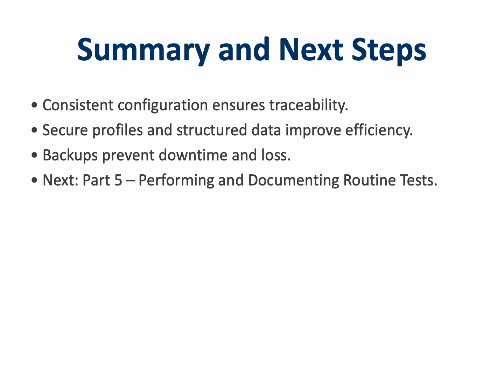Configuration determines whether your Rigel 288 Plus is merely functional or truly efficient. By applying consistent settings, defining clear user profiles, and maintaining structured asset IDs, you build a dependable testing ecosystem. Security features like password control and regular backups protect data integrity, while database alignment ensures seamless traceability. This level of preparation not only simplifies maintenance, but also elevates professionalism in biomedical practice.